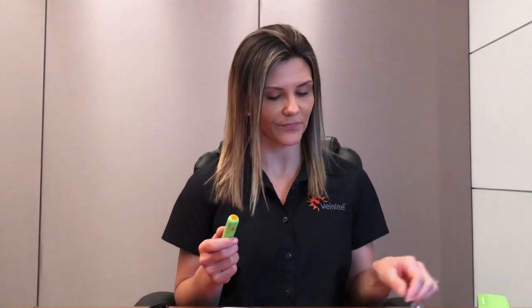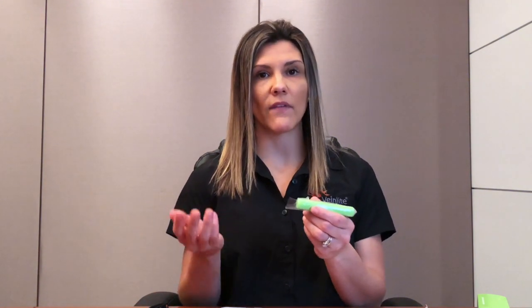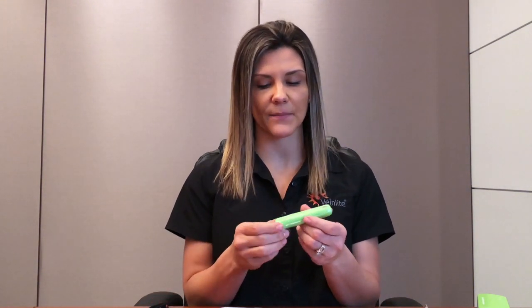To use the Veinlight Neo, you will need to protect the Neo with a disposable plastic cover. A pack of covers will need to be purchased separately. Simply insert the Neo into the cover, then fold the bottom flap over to completely enclose the device. The Veinlight Neo is now ready for use.